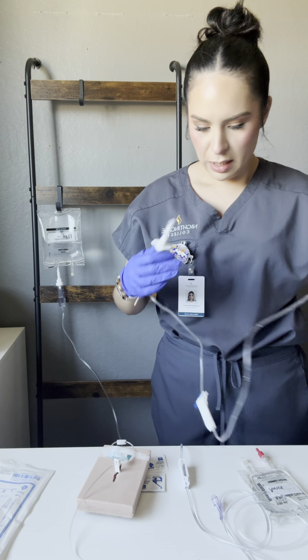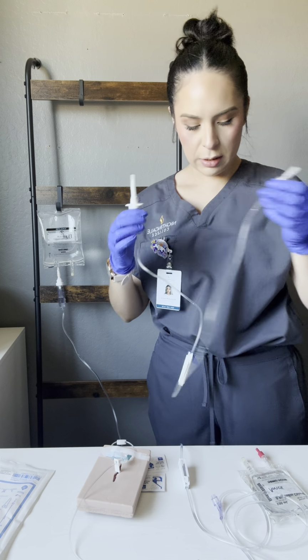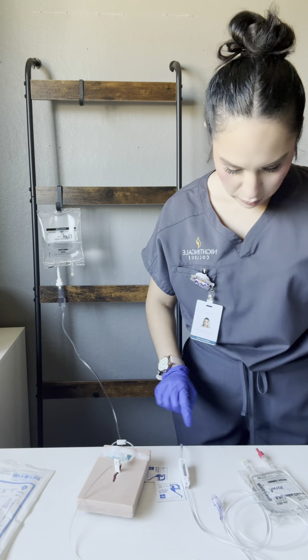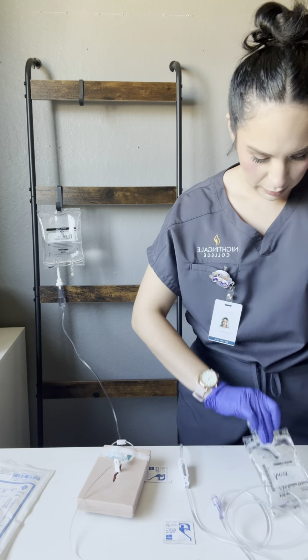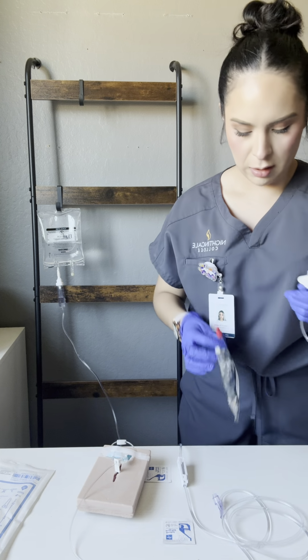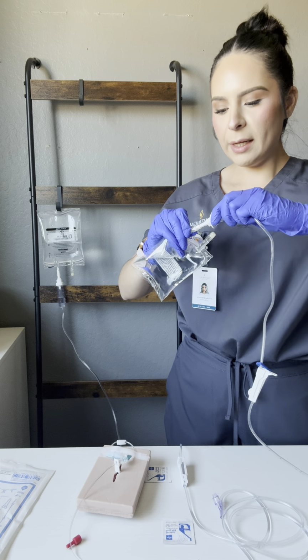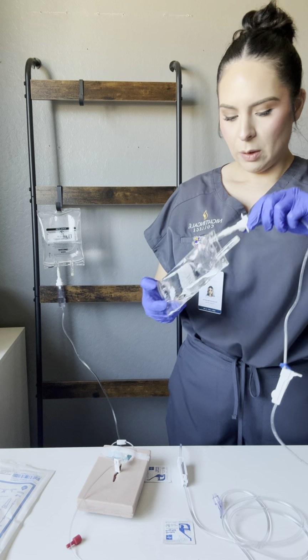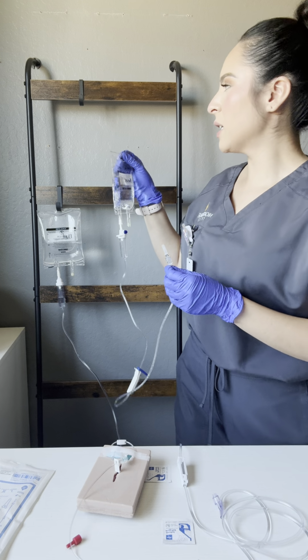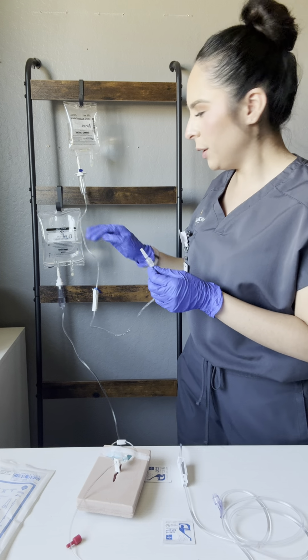I'm going to open up my secondary tubing set, which is going to be for my amoxicillin. And I am going to want to make sure that the roller clamp is rolled down so that our line is closed. I am going to also want to remove the spike end and then this end cap. And then we're going to spike our bag. We are, again, going to want to make sure that our bag is hanging at least 30 inches above the IV site and that we're hanging our piggyback above our fluid.